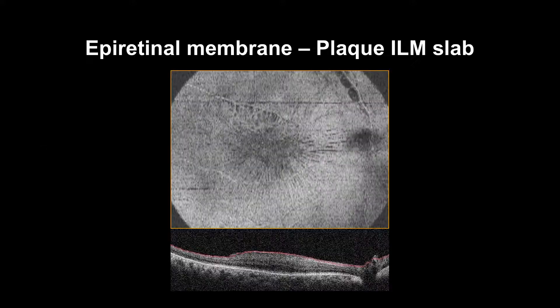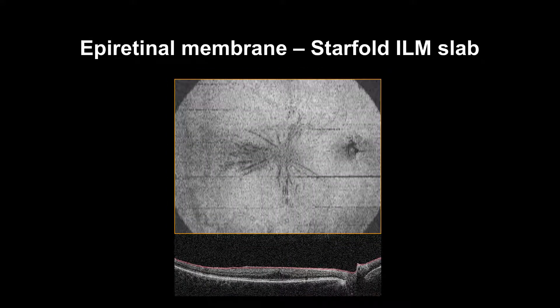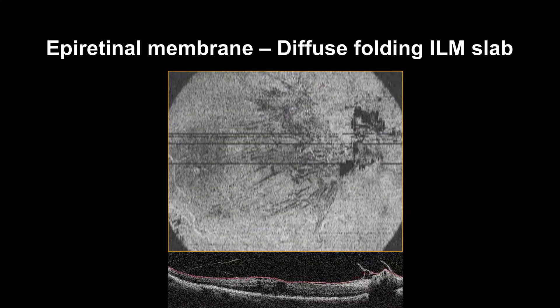The epiretinal membrane has unique patterns on EnFace. The plaque will appear as a plate on the ILM slab, radiating straight or end-curved hyporeflective folds. Please note how the fovea is absent. Star folds can be one or multiple, central and non-central, which look like multiple hyperreflective foldings. Please note the blink artifact and how the fovea is absent. Diffuse folding can appear as hyperreflective folding in the macular area.